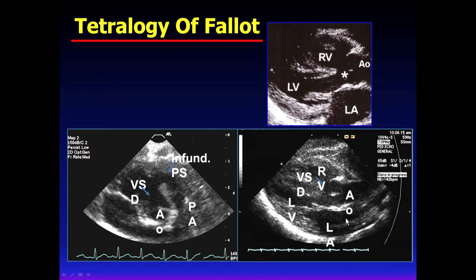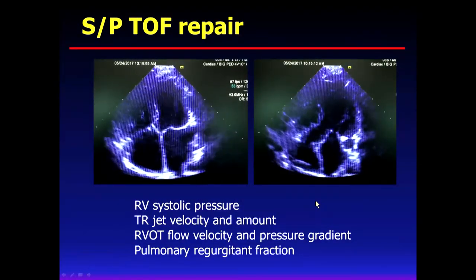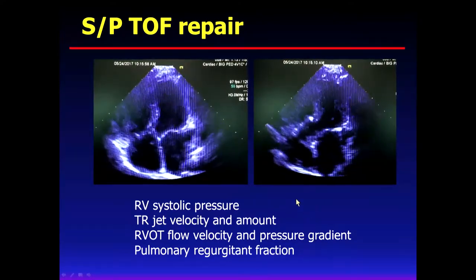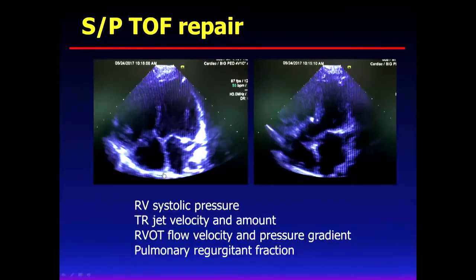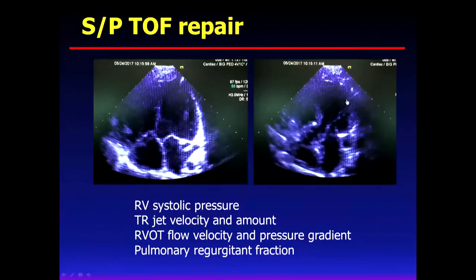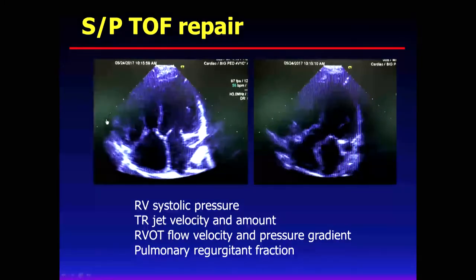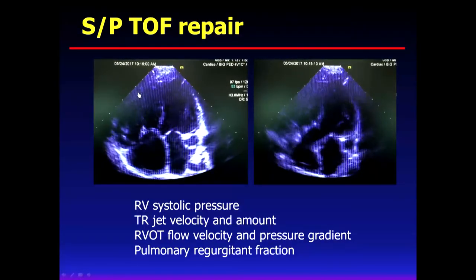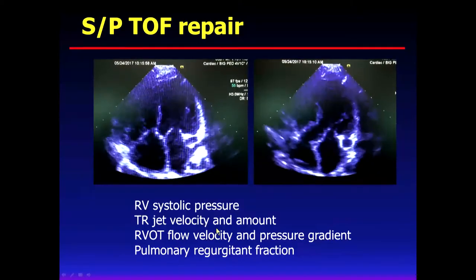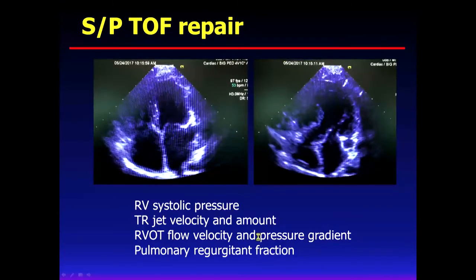So that is tetralogy of Fallot. If we repair a tetralogy of Fallot patient, this is a 10-year-old patient who came yesterday to my clinic, so I quickly tried to record in four-chamber view. The RV looks still okay, but you can notice the LV to aorta is a little angled, and we need to follow her tricuspid valve, LV, and pulmonary artery as time passes. RV systolic pressure is okay, with the TR jet, RV flow velocity, and PS or PI recurrence like that.